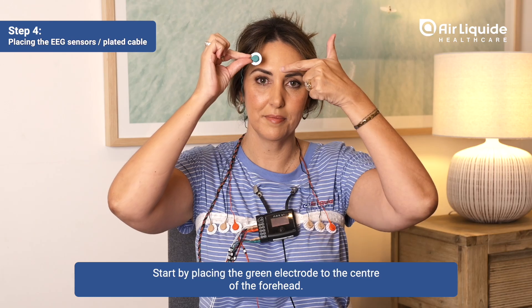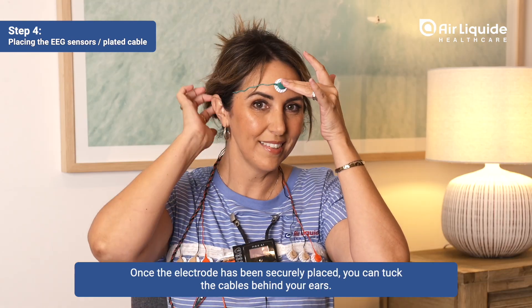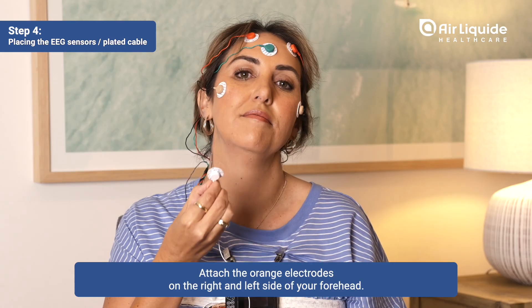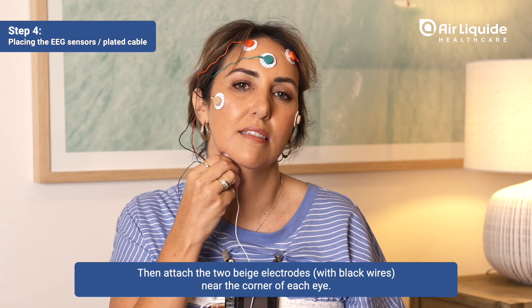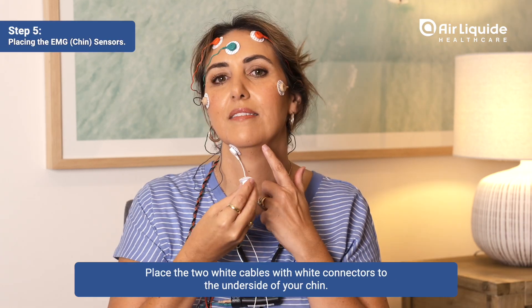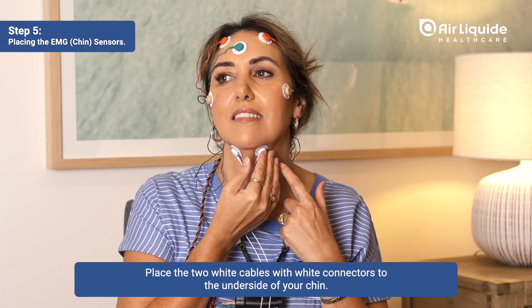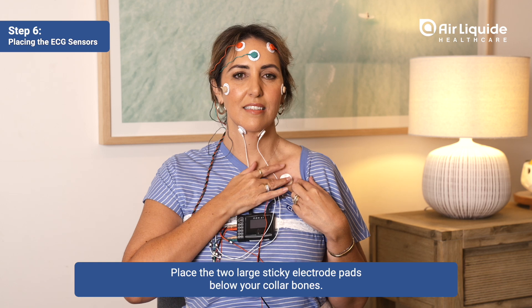Start by placing the green electrode to the center of the forehead. Once the electrode has been securely placed, you can tuck the cables behind your ears. Attach the orange electrodes on the right and left side of your forehead. Then attach the two beige electrodes with black wires near the corner of each eye. Place the two white cables with white connectors to the underside of your chin. Place the two large sticky electrode pads below your collarbones.